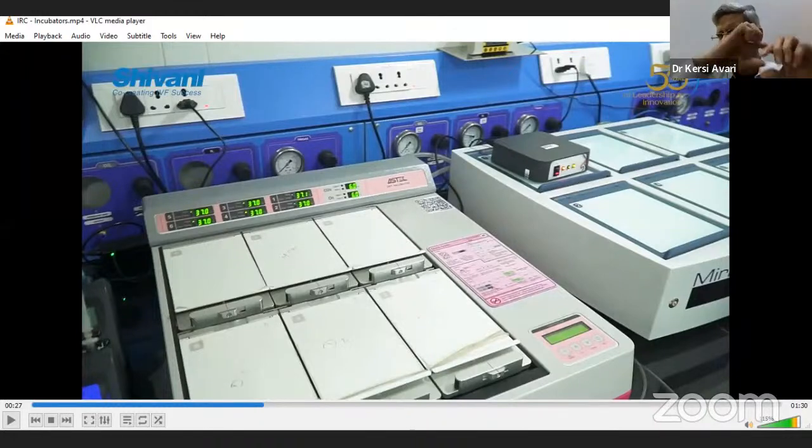If you recollect the diagram of the tube which I had shown you, the initial part had shown in the early cleavage that the oxygen tension is less. As it grows further, develops further, at that time it becomes more. So oxygen, as far as cleaving embryos is concerned, its concentration and tension or pressure has to be regulated properly. These are all magnetic press lock switches. They will just flap open like this. And inside, I think I have a long video of it, but to see the nitty-gritties of such incubators, your physical presence and observation is very essential.